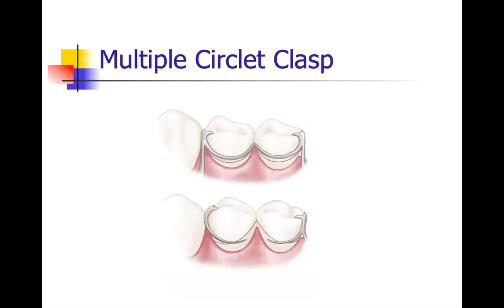The multiple circlet clasp simply consists of two opposing circumferential clasps joined at the terminal end of the two reciprocal arms.